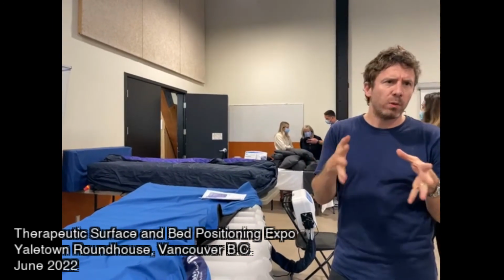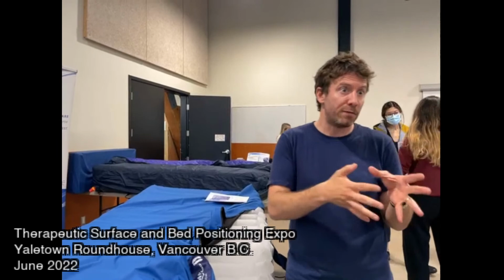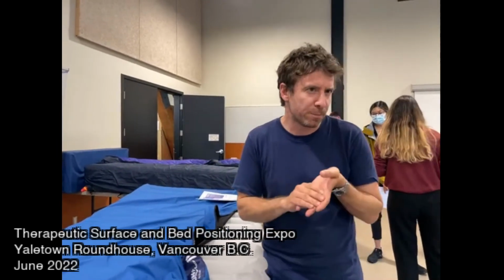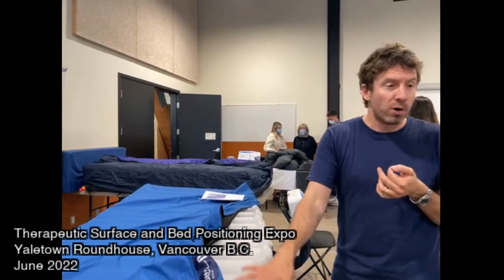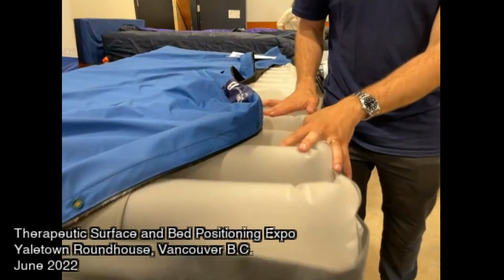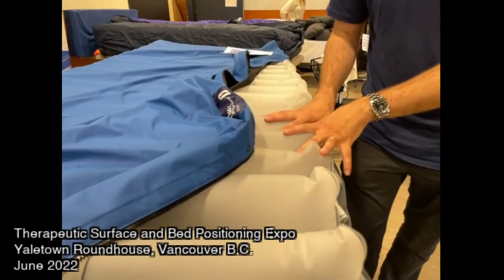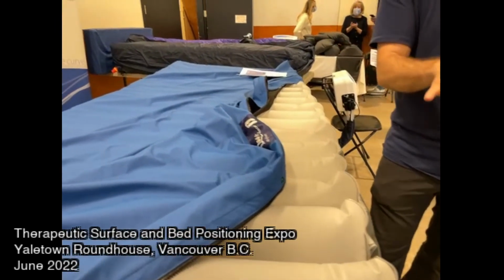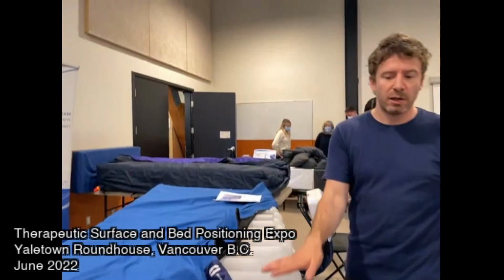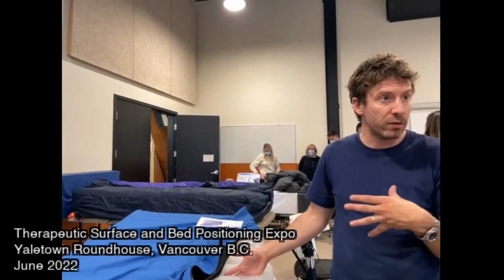And there are some mattresses that will be in between. There's low airflow or there's high airflow. We're looking at a surface that's going to be a medium airflow. It's going to have more cells. If a mattress had 2 cells, it would probably be quite uncomfortable, so you'd really feel that alternation. When a mattress has more cells, it's more comfortable. So we're actually looking at a mattress that has 24 cells.